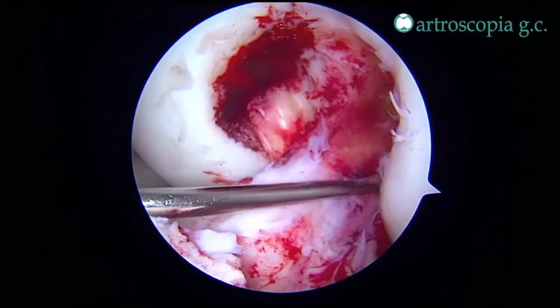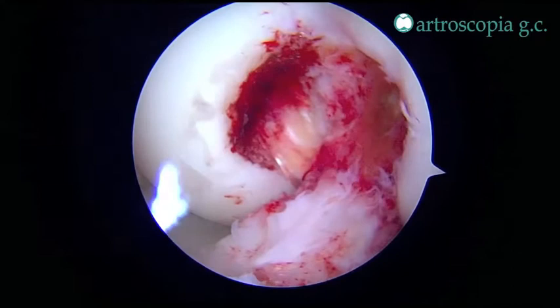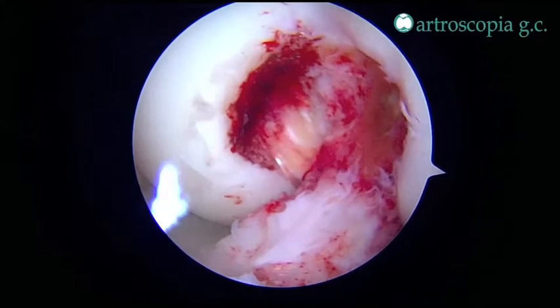This is the final appearance of the construct with adequate tension of both the ACL and PCL without laxity on anterior and posterior drawer tests. We would like to thank the whole team.